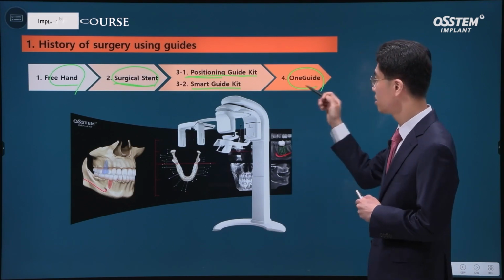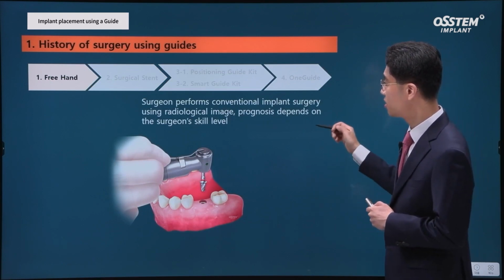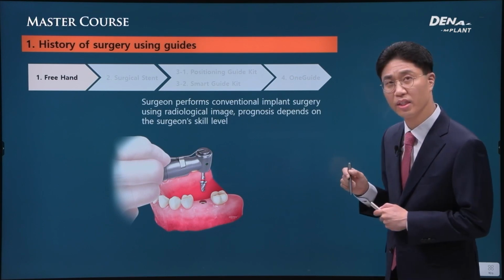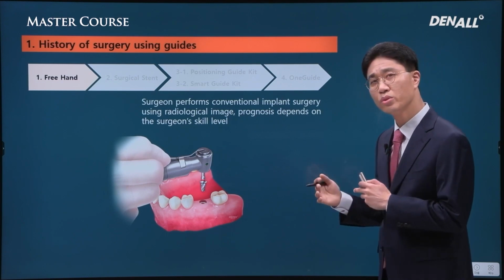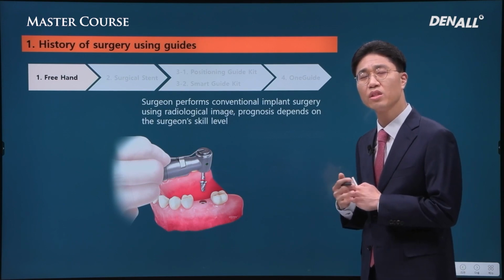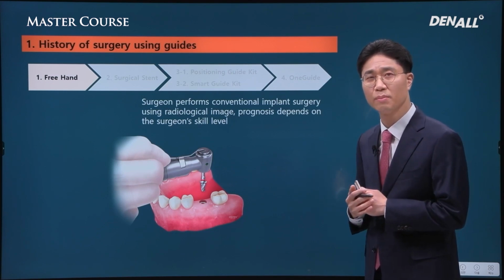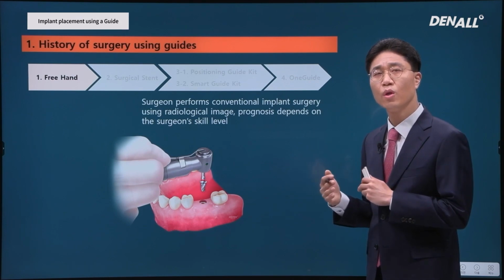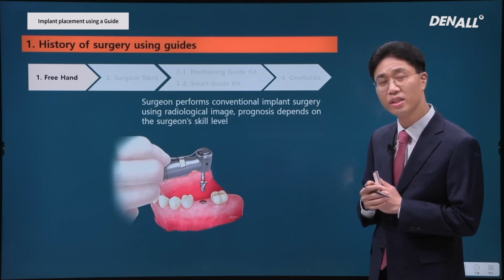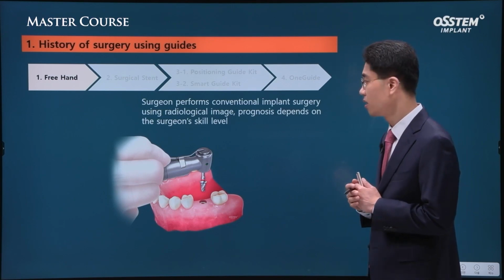If you look over here, the implant is being placed freehand and it depends a lot on the surgeon's skill. Yes, it is true that there are doubts as to whether the dentist with absolutely no implant placement experience will be able to place implant 100% appropriately using digital guide. That can be tough. However, once you know how to open flap and differentiate the different bone qualities and understand the different implant drilling procedures, then naturally you come to rely on digital guides to get the appropriate path.